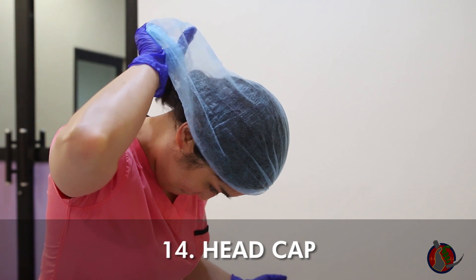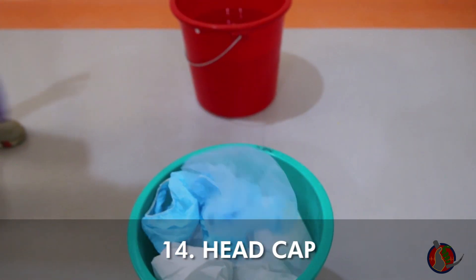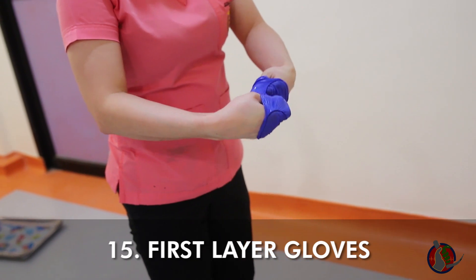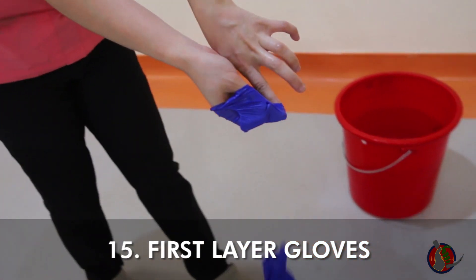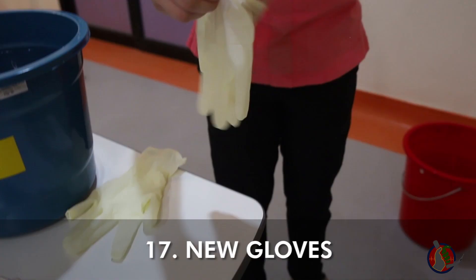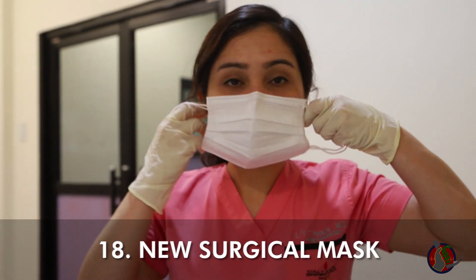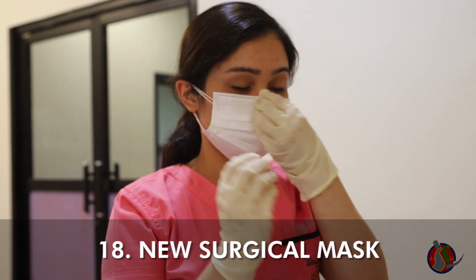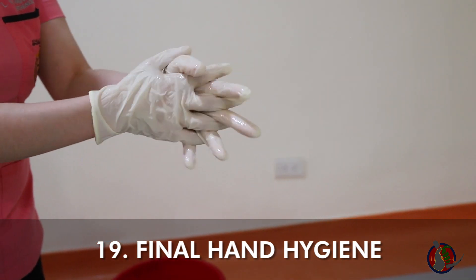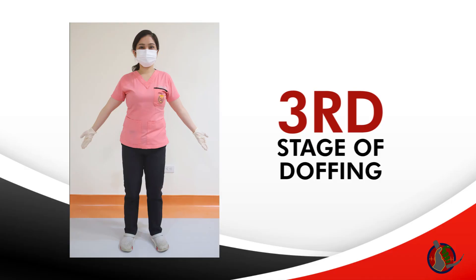Bend forward slightly, remove the head cap from the back, rolling it inside out, and throw gently. Remove the innermost gloves using the beak method and throw gently. Do hand hygiene. Don new gloves. Don a new surgical mask. Do hand hygiene — repeat hand hygiene as necessary during doffing. When in doubt, do hand hygiene. You have successfully doffed all three layers of PPE.